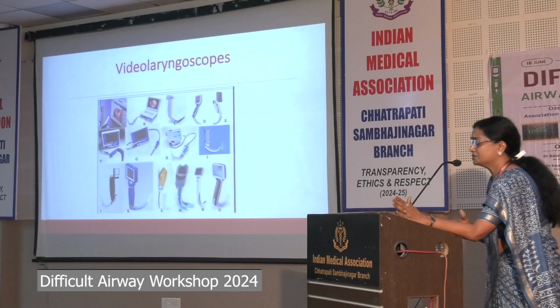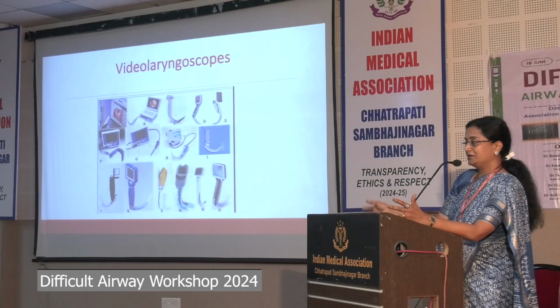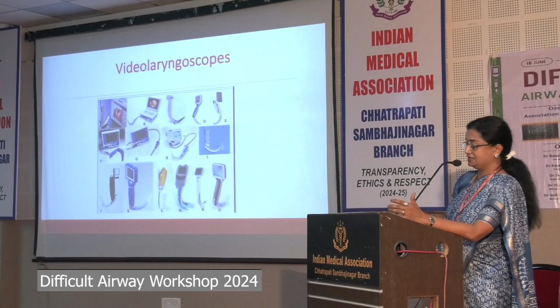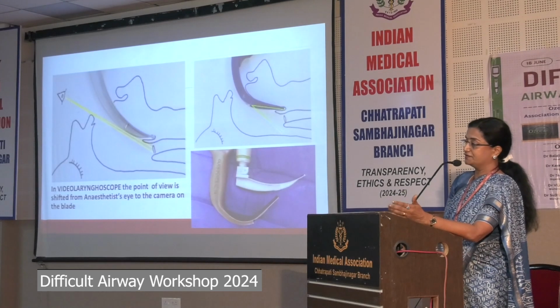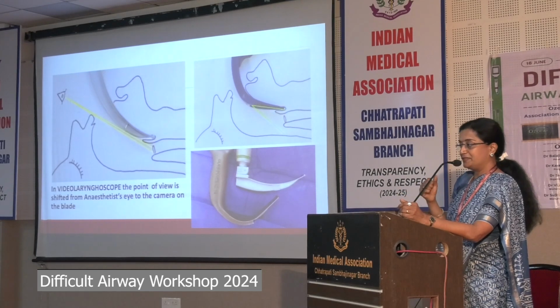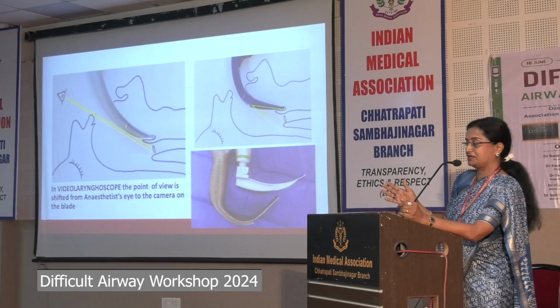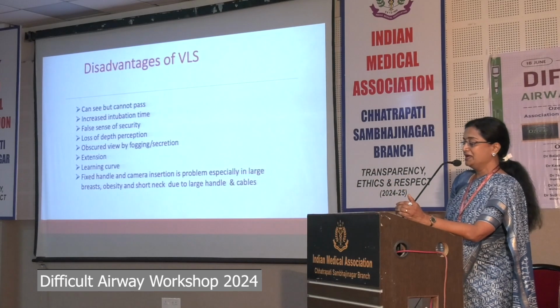Now, people do not check their laryngoscope when they have a video laryngoscope. So many video laryngoscopes are available in the market. As Balaji sir said, it eliminates the need for a direct line of sight, thus allowing us to stand tall and erect. As anesthetists, we have been bending throughout our life, right from 1945 when Macintosh came, and 75 years later, we are standing tall and erect because of the video laryngoscope.